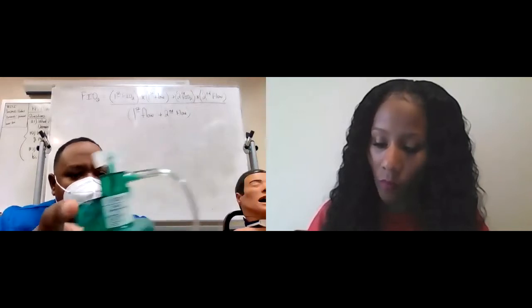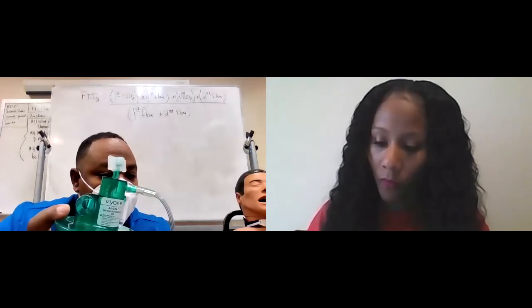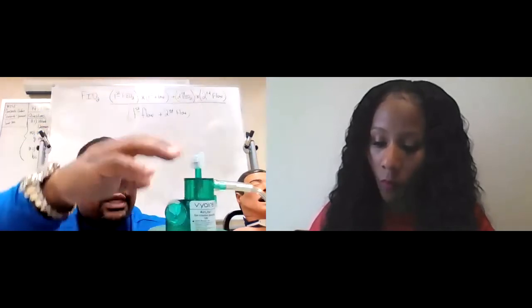Very high flow. Now, you will see that it encompasses the Bernoulli principle, right, with the straw. But notice, it doesn't have a Venturi. The jet or the GIN nebulizer does not have a Venturi port on it. So therefore, the FiO2 coming through here is going to always be what? 100%. Because this goes to the oxygen, right? We'll hook this up to the oxygen, either the wall or the tank or whatever. It has the Bernoulli principle for the water, but it does not have any holes or any Venturi setup, right? So that's 100%.